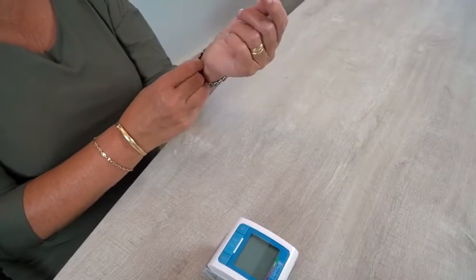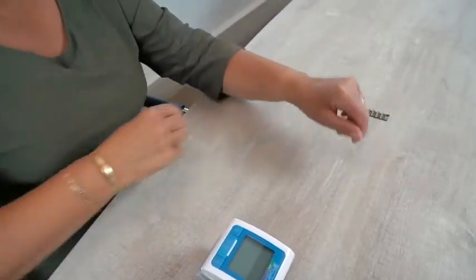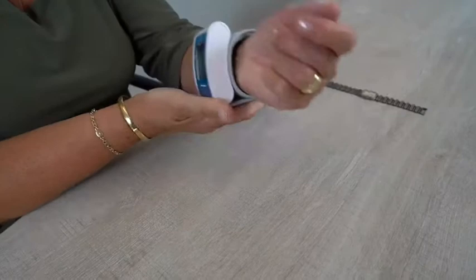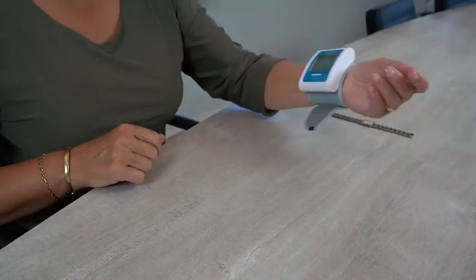Remove your watch, bracelets, or other jewelry on your left arm. Place the cuff on the wrist of your left arm with the palm facing up. Make sure the cuff is at heart level.